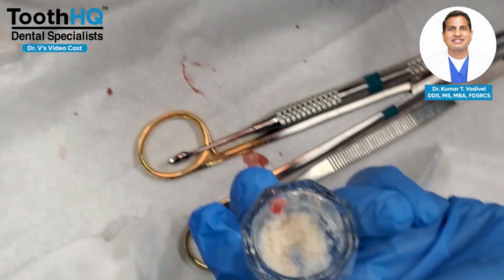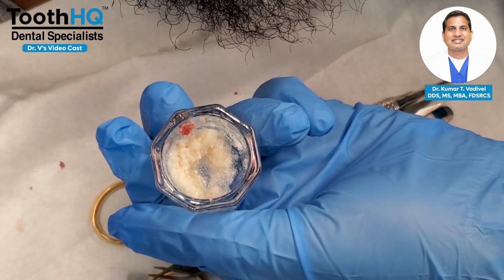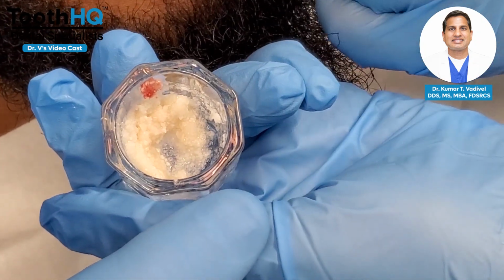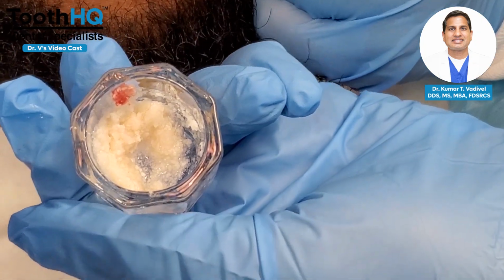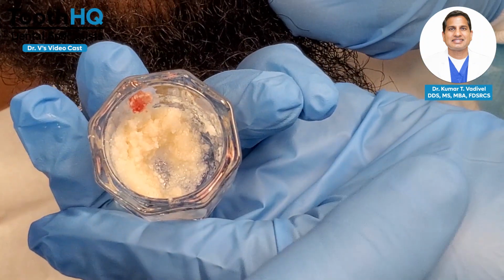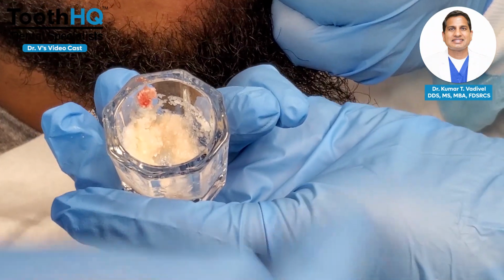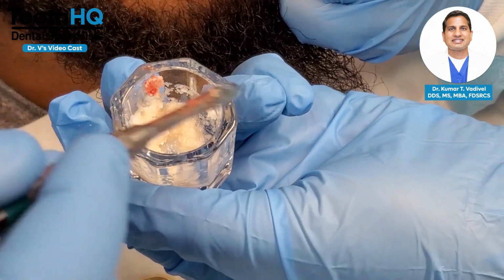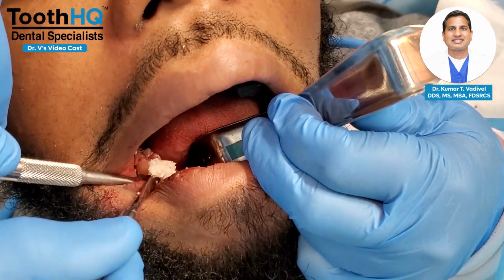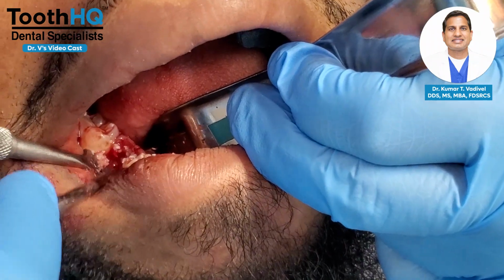We'll start from here. Okay. So I call this a pour and pack technique. It's almost like you're pouring the bone and packing it, right? So you have your assistant hold it, and if you have a very good assistant, sometimes they can really help you with even feeding the bone. Because a lot of retraction is needed and one assistant is not able to do everything that we need, I'm going to have the other assistant hold it right here, and I'm going to put the bone here. So remember the packing. You actually go ahead and get the bone and pack it here.